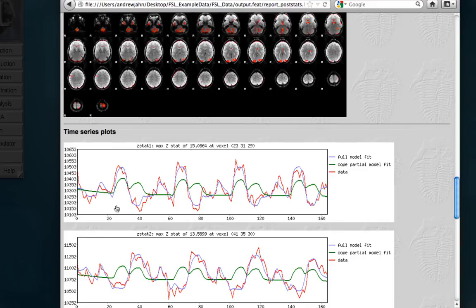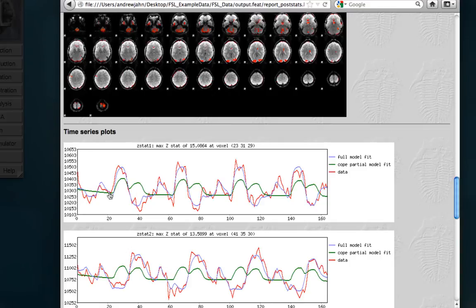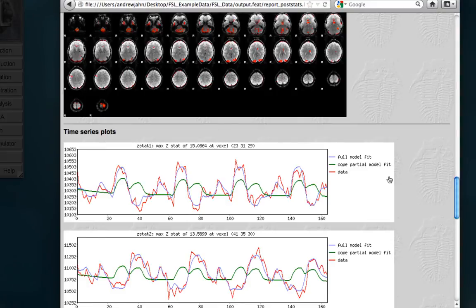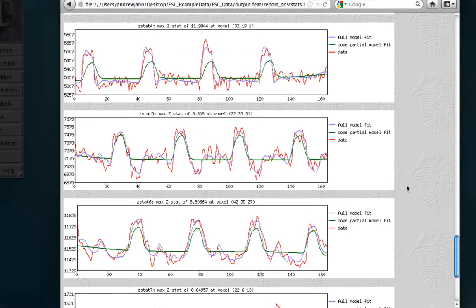Now, in red is the raw time series data. You can see it's pretty noisy, it has a lot of variance, but it seems to match up pretty well with what our model would have predicted. So, for example, each time we had a person tap left, and we subtract that from the tap right regressor, you see a pretty good fit. And specifically with this green line, which is the COPE partial model fit, that refers to just that contrast or just that regressor of interest. And they're usually more interpretable when you look at things like just the simple effects.